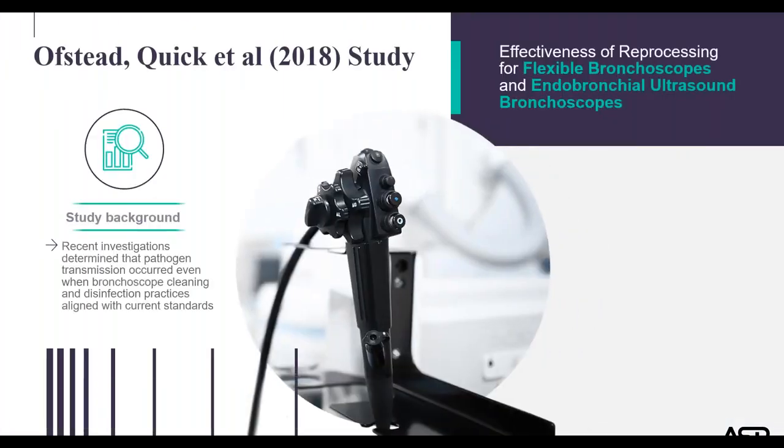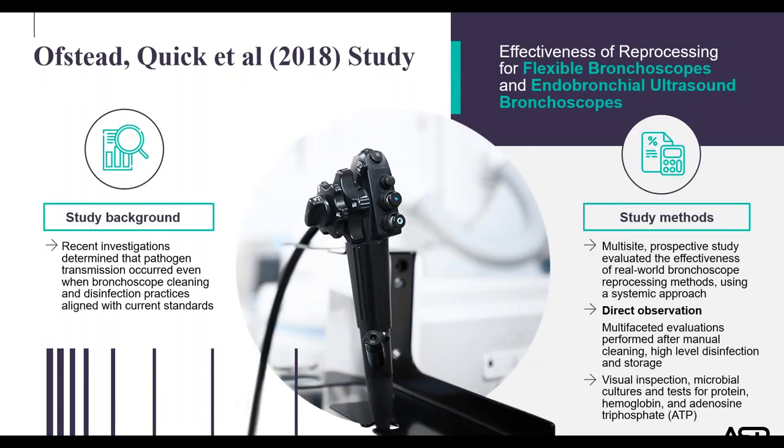As Janet also mentioned, we want to spend a little time sharing information around a recent study Cori Ofstead published. In 2018, Ofstead published a study that evaluated the effectiveness of bronchoscope reprocessing. And in the study background, it identified that pathogen transmission occurred even when reprocessing policies were in place and even when cleaning and high-level disinfection occurred.